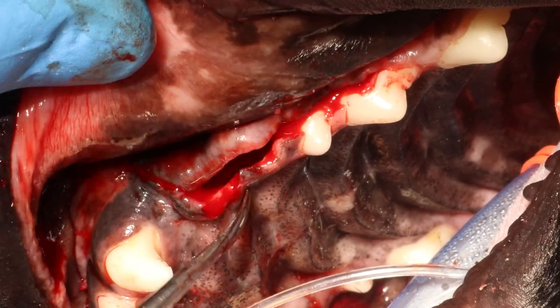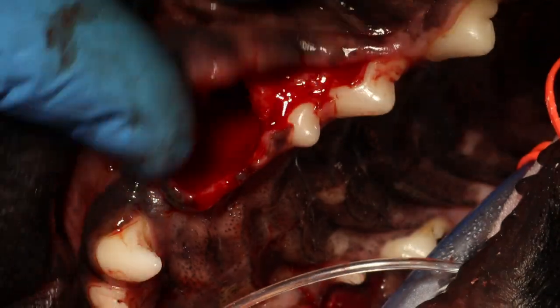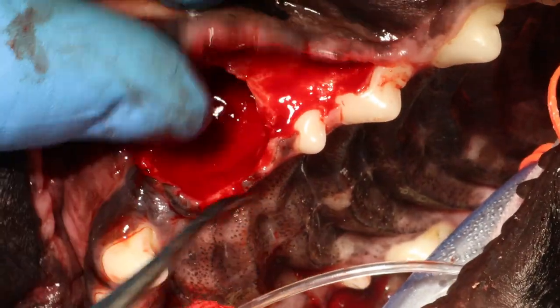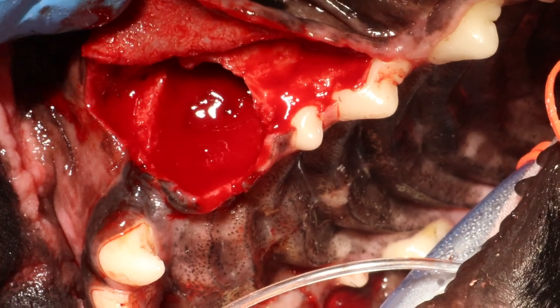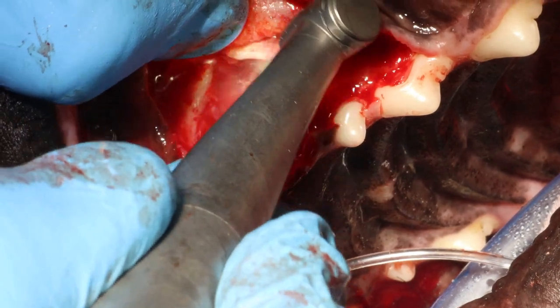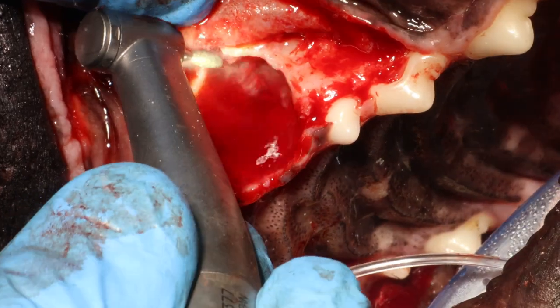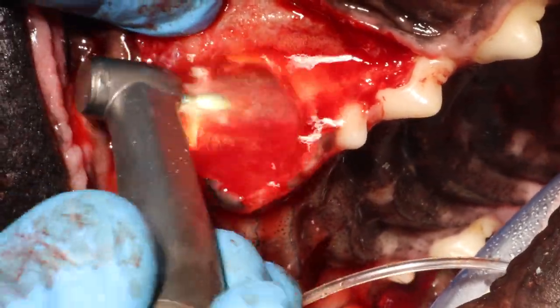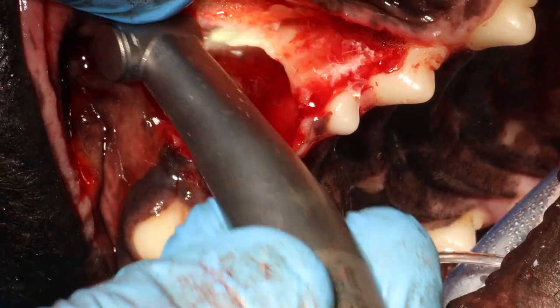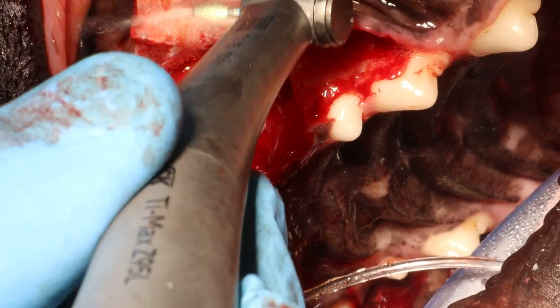As you can see, when I am placing the flap over the defect it stays quite nicely. This means we can go ahead and suture. Here I am using a football diamond burr, medium grit, to smooth the edges of the bone — you want them to feel smooth to the touch.